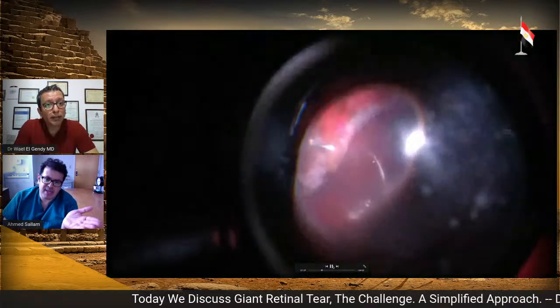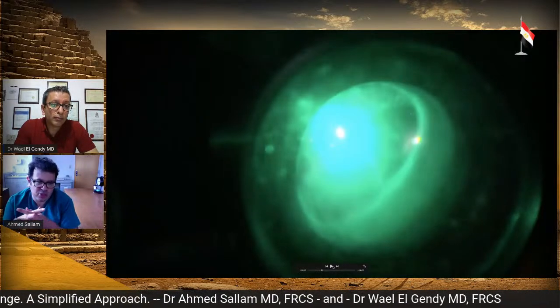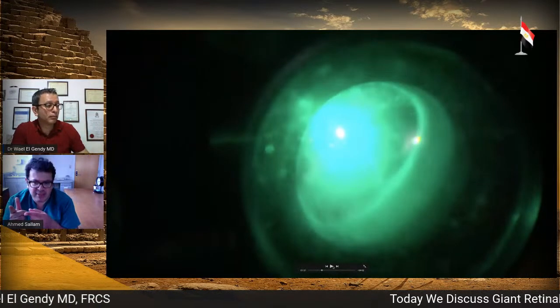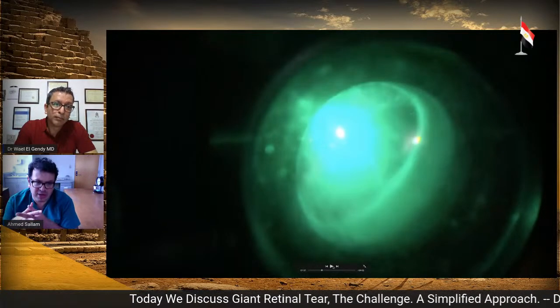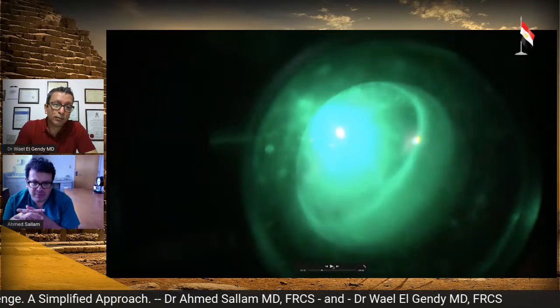The advantage is that, as you alluded to, you see a better view under air, and there's no problem of sloshing the PFCL. There can be a disadvantage if you have an artificial lens with an open capsule, because your view might not be very good under air. So maybe then don't do this under air. Try to finish everything before going to air.